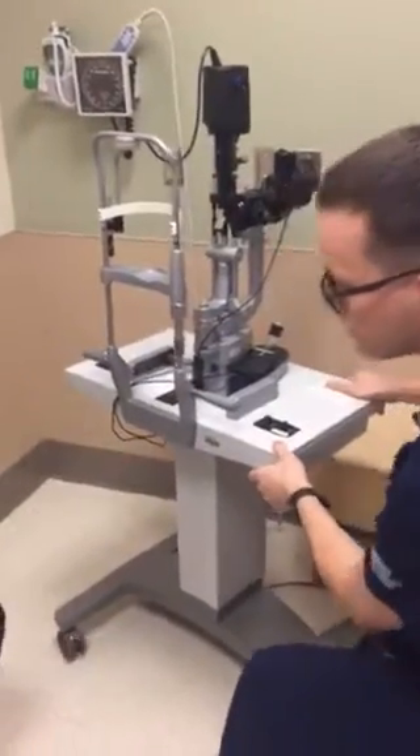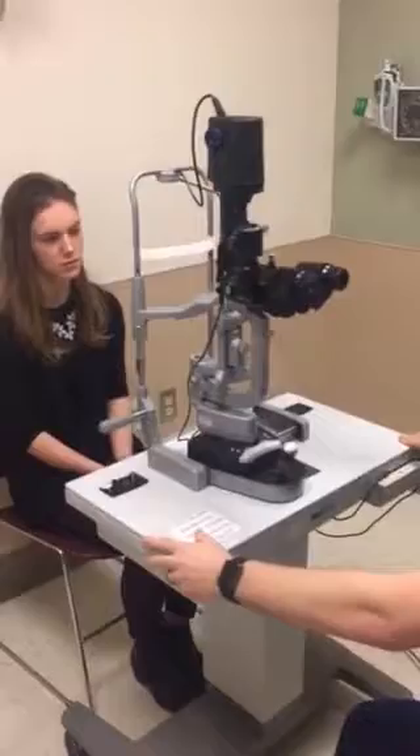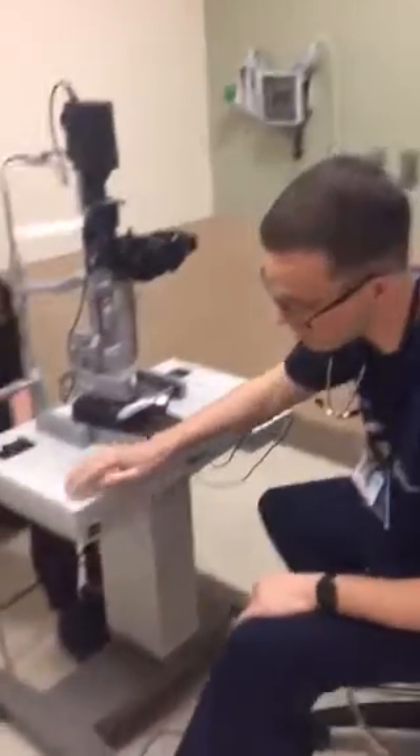The next thing you're going to do is wheel the slit lamp in front of the patient. Make sure the slit lamp is plugged in — you have a plug on the wall, and there's also a plug at the base of the table, which can get loose. Go ahead and put that in and make sure it's good and plugged in.